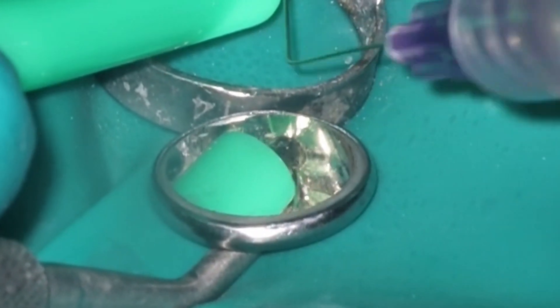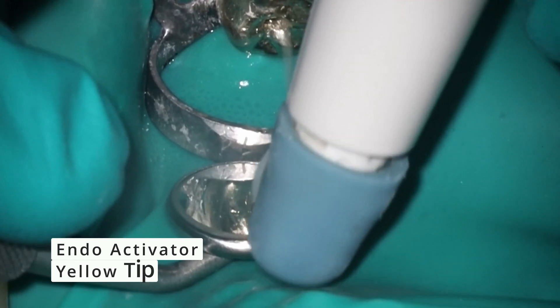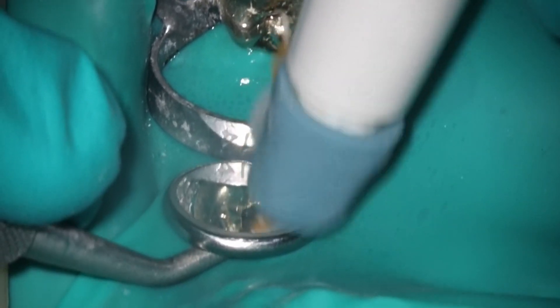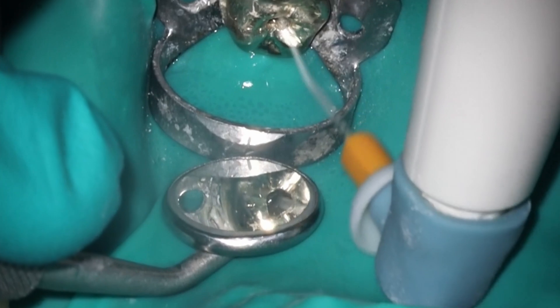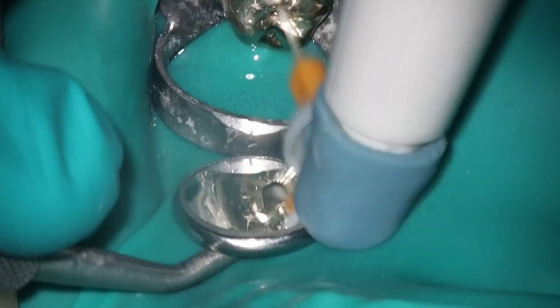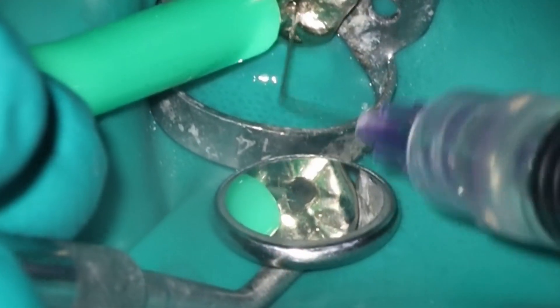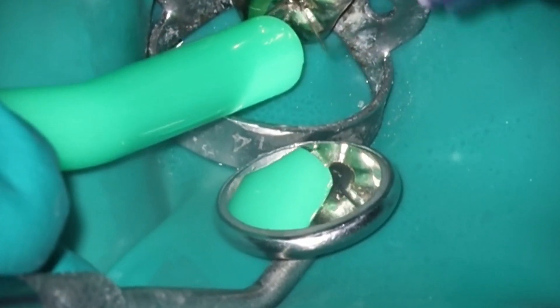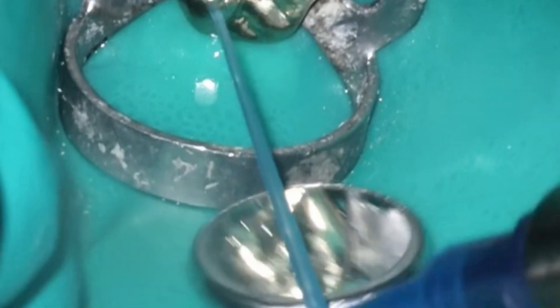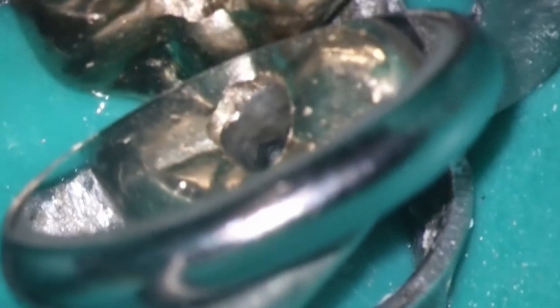Going through the final rinse process — I kept this one in here to show you. There's really no drainage; even the bubbles have stopped at this point. So those two factors right there make me feel very comfortable that even though there are apical findings, I can finish this in one visit and not be concerned about it. I have been loving using these yellow-tipped endo activators, especially with these smaller 1704 sizes. The red ones are just a little too large and don't really work that well in these small shapes. Rinsing it out with a little bit of isopropyl alcohol just to get everything nice and dry — and you can see nothing coming up with micro suction. That is a really good sign that we'll be able to get things taken care of.